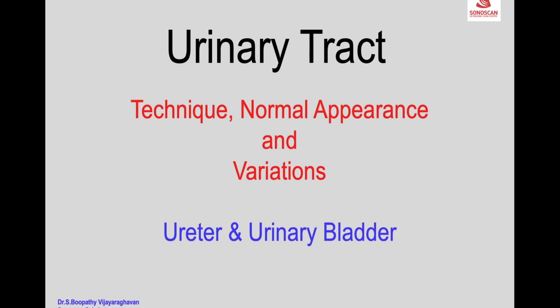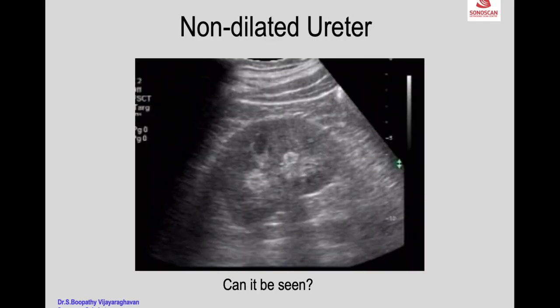Sonography of the urinary tract. Technique, normal appearance and variations. Part 2, we have to move the transducer to trace the different parts of the ureter.